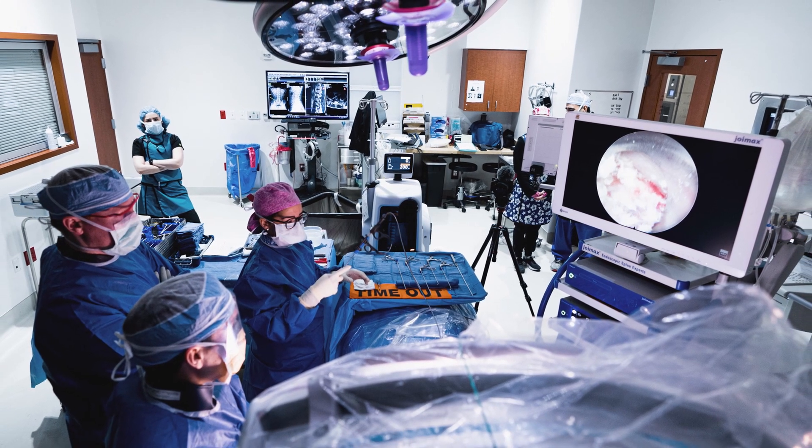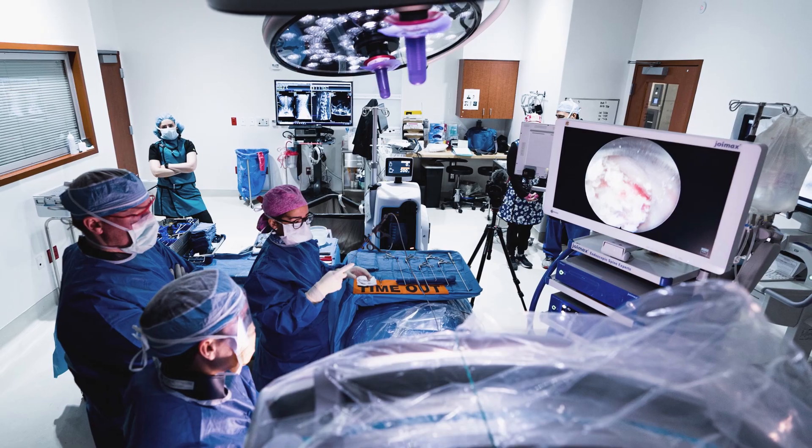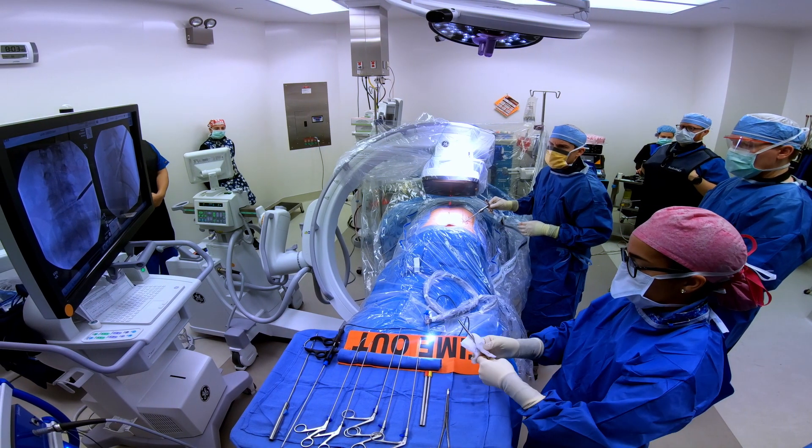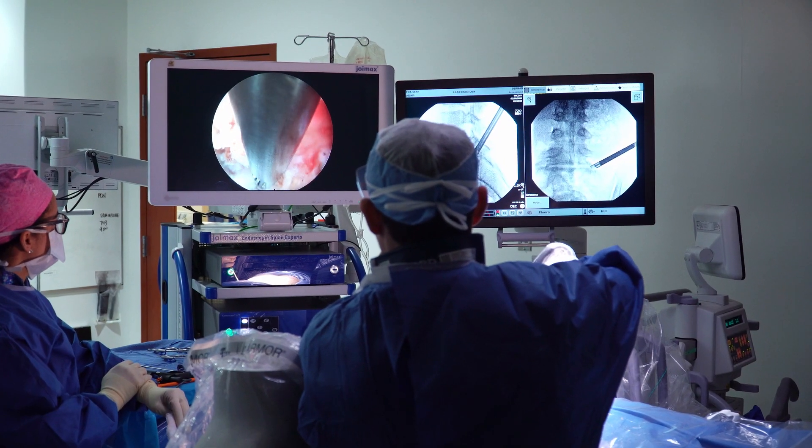The surgery, rather than looking directly into the patient's body, involves looking on a screen. By making that leap to using a camera rather than looking with your eyes or with a microscope, it allows for even smaller incisions, less tissue damage, and quicker recovery.